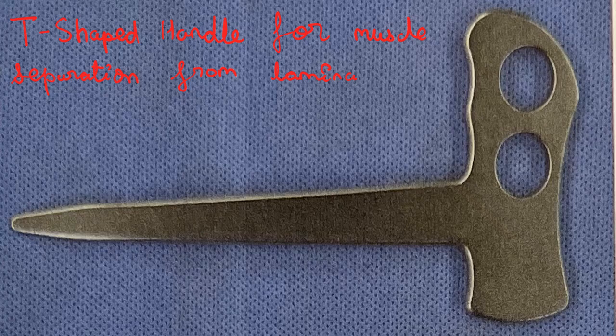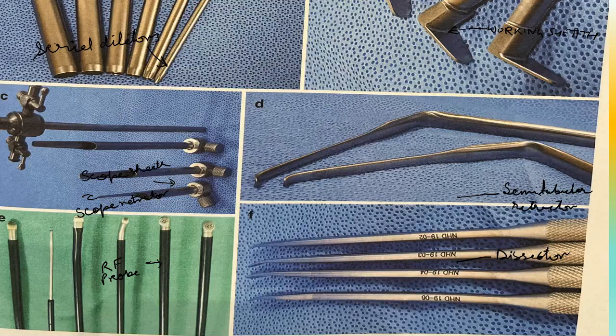Instruments: most of the general spinal instruments can be used, but a few special instruments like this T-shaped handle. This T-shaped handle is for muscle separation from the lamina and opening of the interfascicular space.